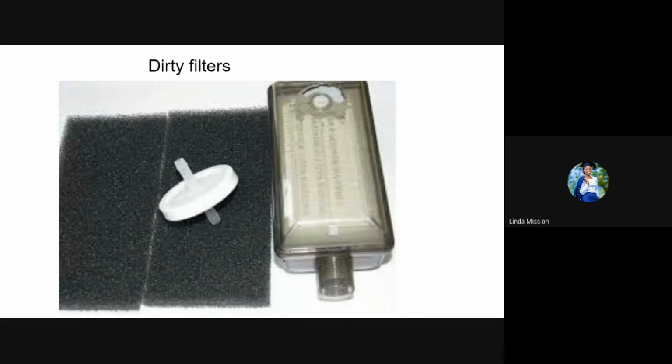And dirty filters can also cause an increase in the noise level in oxygen concentrators. When the filters, such as the intake filter and gross particle filters, get clogged with dirt, the pores on the filters are reduced in size, and air is forced to pass through the filter, which produces a hissing sound, and this causes an increase in the noise level. The image in the graphics shows different filters. That is, there's a bacteria filter, gross particle filter, and also an intake filter, which are used in oxygen concentrators of different models.